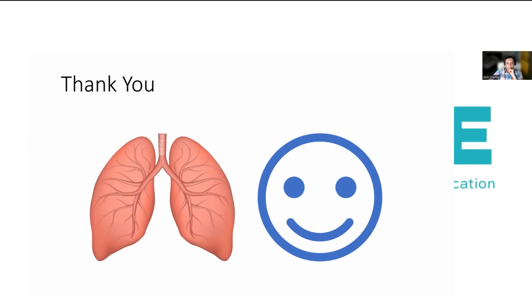Just, Alok, thank you very much for this presentation. But just if you have for the next session, if we can have some example of meconium aspiration syndrome. So I think I have a gap in, I didn't view ultrasound for this kind of babies, especially after intubation. No problems. Absolutely fine. Happy to share that with you.